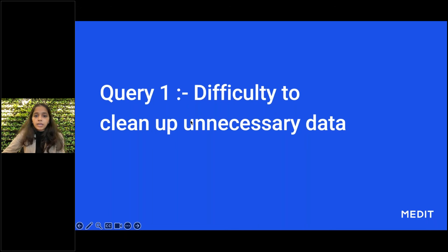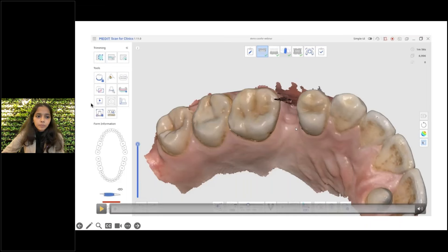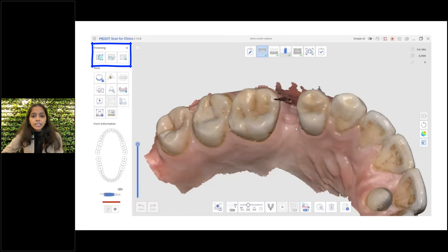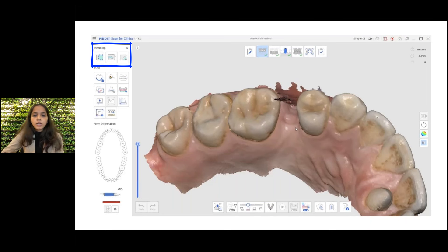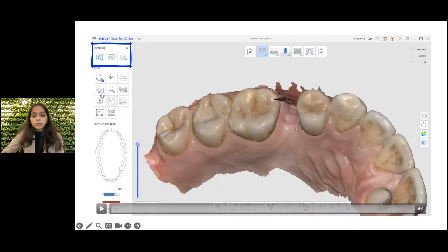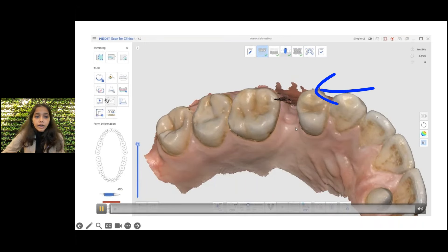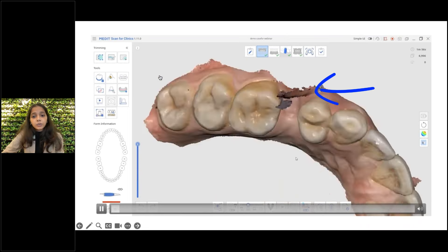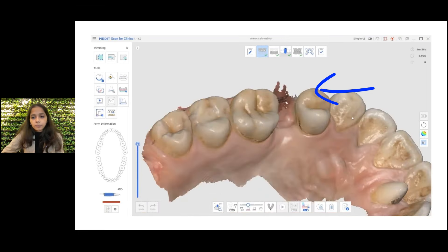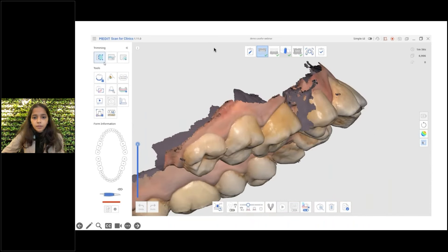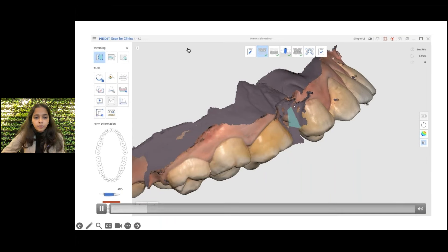In such cases, how about we fix the scan ourselves and send it to the lab? In Medit Link we have three trimming tools that can be used to edit our scans: the polyline tool, the brush tool, and the quick trimming tool. We might have used the polyline tool to edit scans, but as we see here there is an artifact — let's see what happens when I use it to edit with the polyline tool. I have selected the area using the polyline tool.